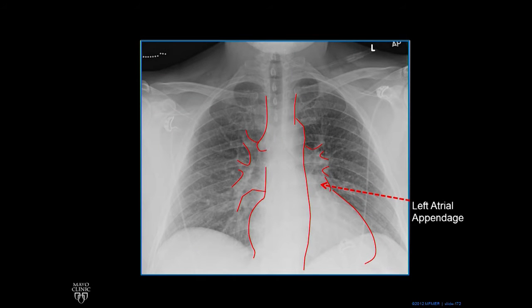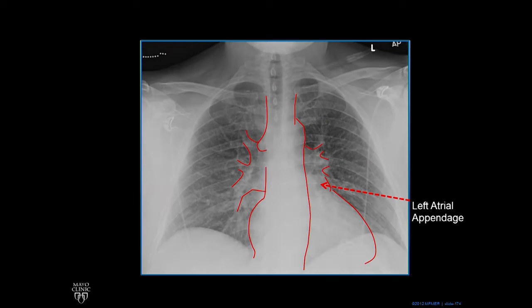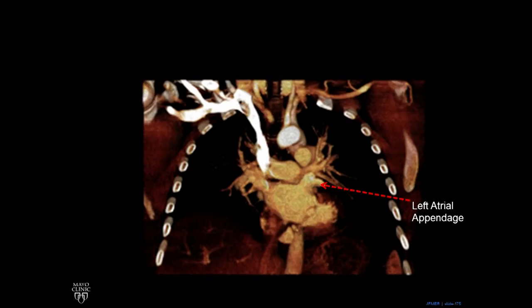That little bump — that's the left atrial appendage. The left atrium is made from two parts embryologically: a smooth part which comes from the lungs, which is the pulmonary veins, and a small, trabeculated, wrinkly, bumpy part which embryologically comes from the heart. And it's this little piece of tissue there, and it forms the left heart border normally. If we scroll back, you can see that little finger-like stump thing — that is the left atrial appendage.